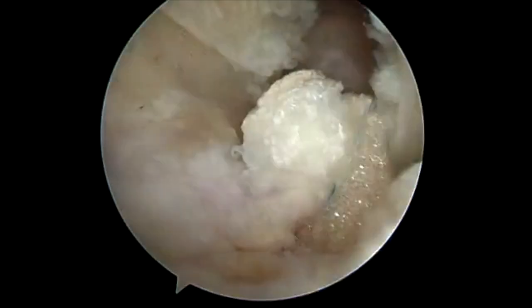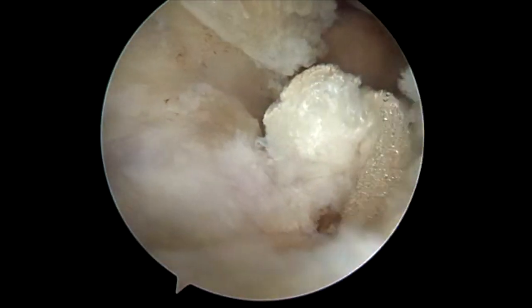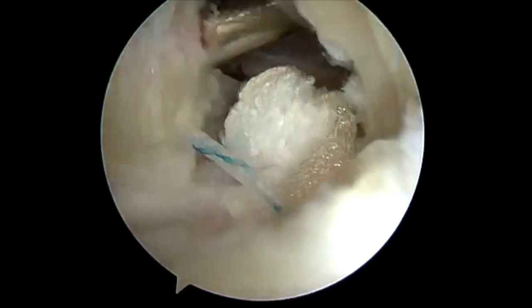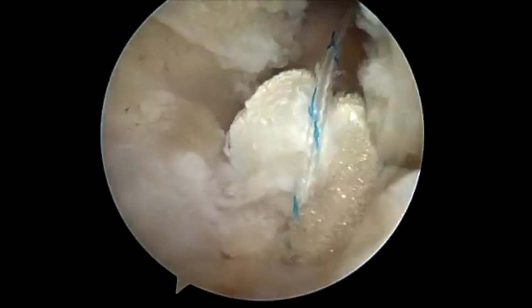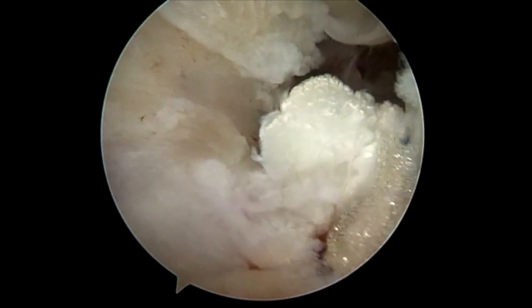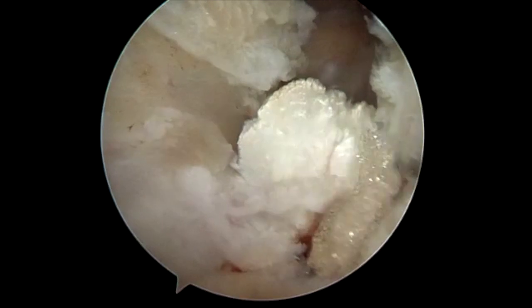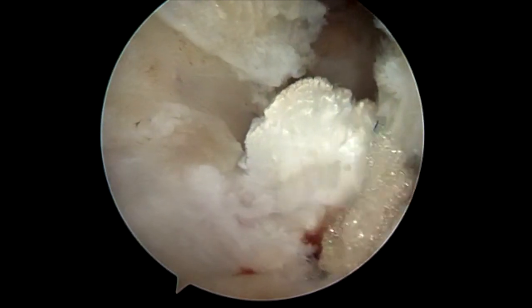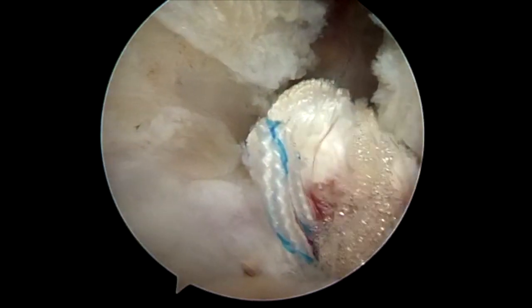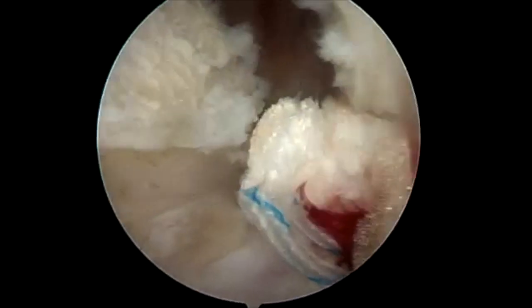I added this to the procedure about four years ago, and I have not had a suture slippage or fixation failure of the bicep tendon since. It takes an extra 30 seconds, but it's cheap, worthwhile insurance. After that's performed, the sutures are trimmed and the procedure is completed.